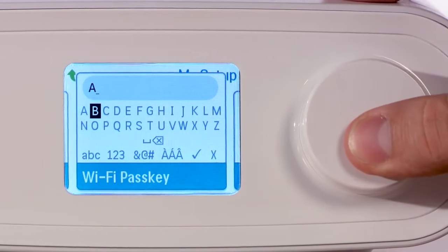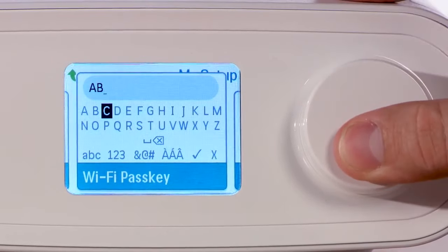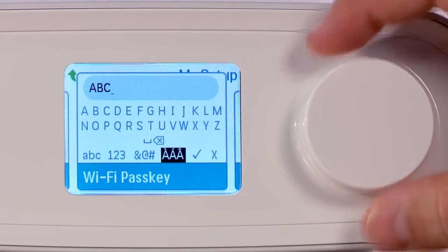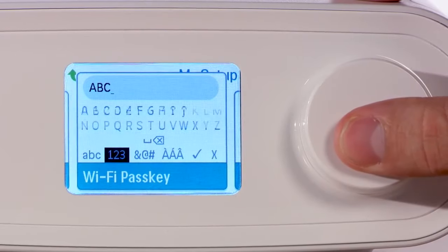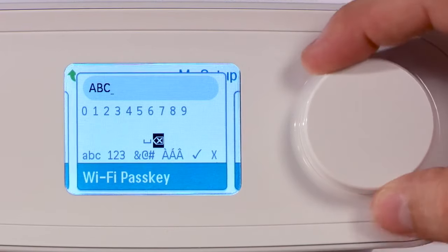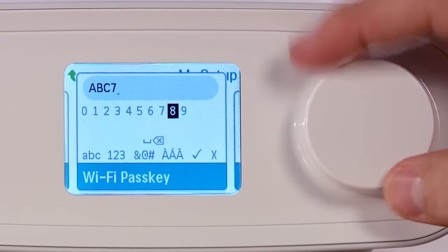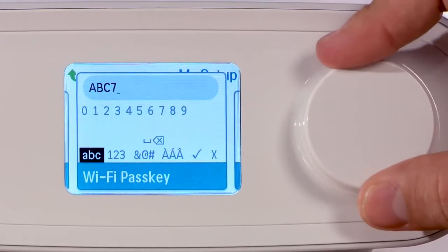Enter your network password one character at a time. Turn the control dial to move to the next character, then press the control dial to select it. Note the selections for upper and lowercase letters as well as numbers and special characters.